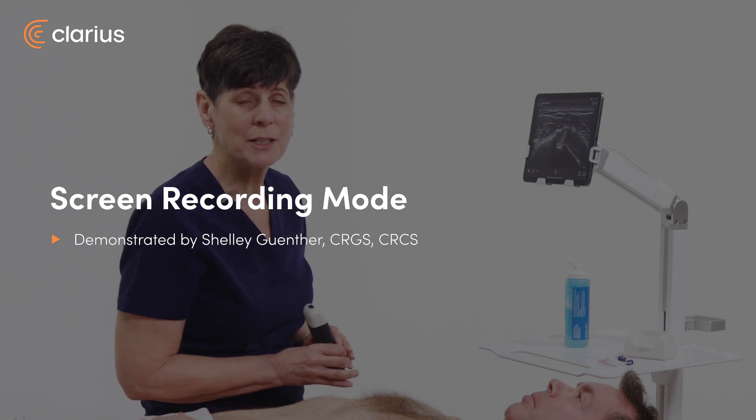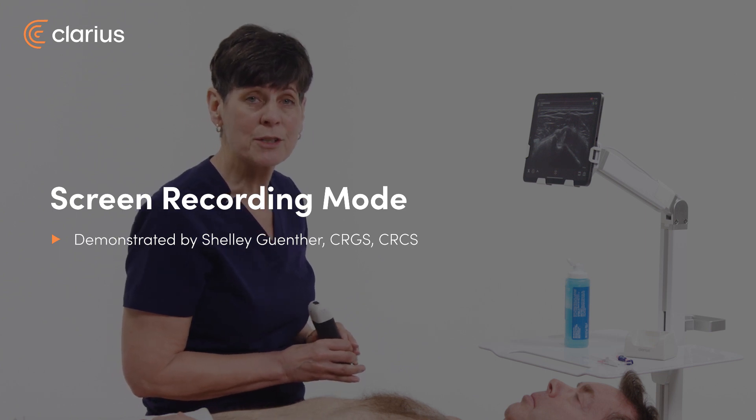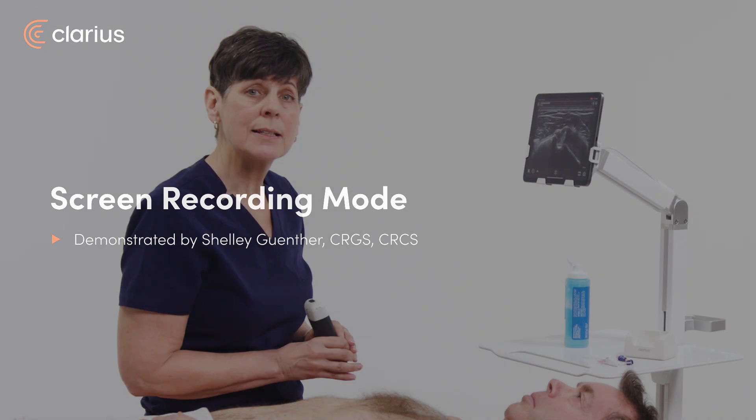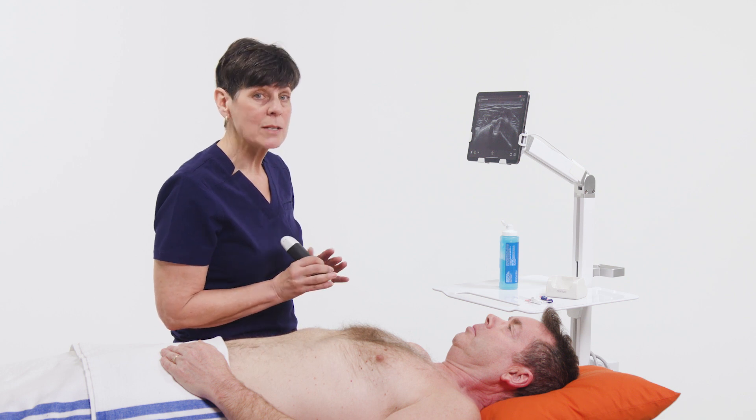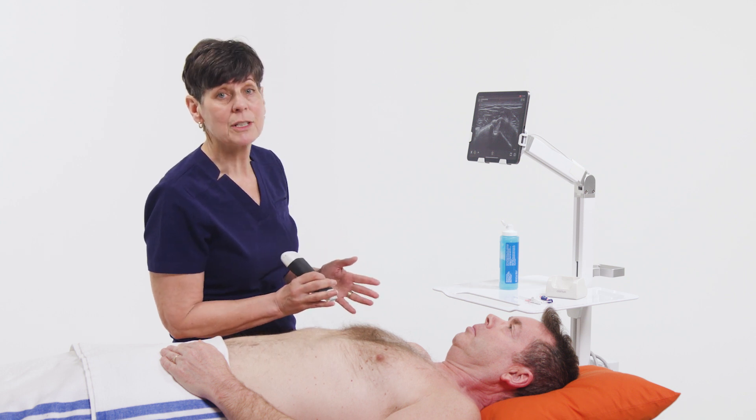Hi, my name is Shelley and today I'm going to tell you about a feature called Procedure Recording Mode. This allows you to take advantage of your device's camera and native screen recording to record a full-length procedure. This is extremely useful for documentation purposes where the ultrasound procedure is required to be recorded. It gives you the ability to record the ultrasound guided procedure as well as the anatomical procedure in real time.